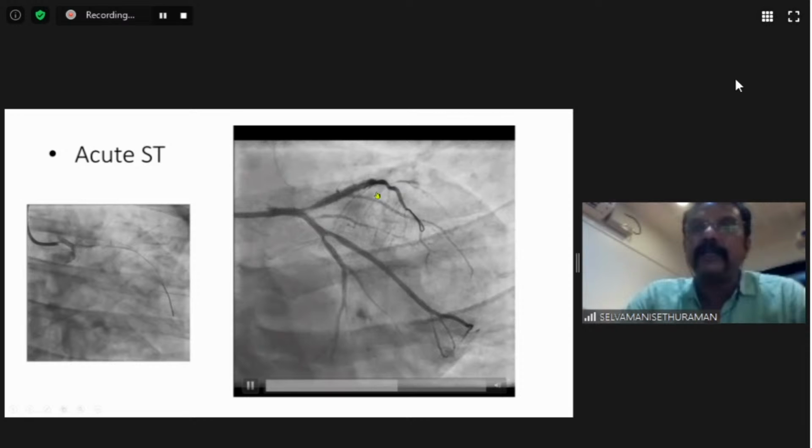Angiographically, it was looking very fine. The flow was good. We couldn't make out anything. But this malapposition was very clearly picked up on the OCT when we did it for the stent thrombosis the next day morning. And again, as I told you, we did nothing. We just put a bigger, adequate size balloon, dilated it, and left it. He is doing well. And this definitely simplifies your treatment. Otherwise, if there is no imaging, you'll have to imagine what the reason is.